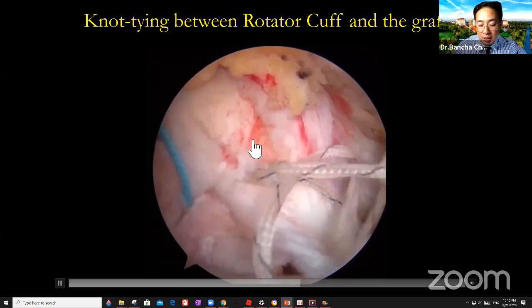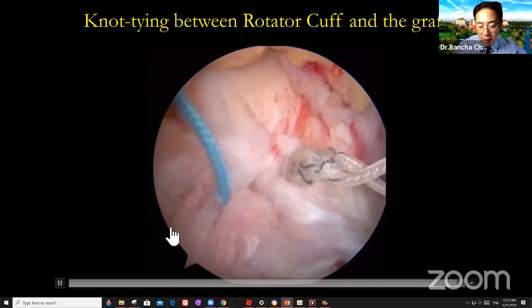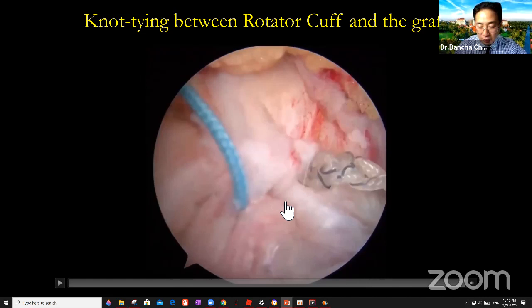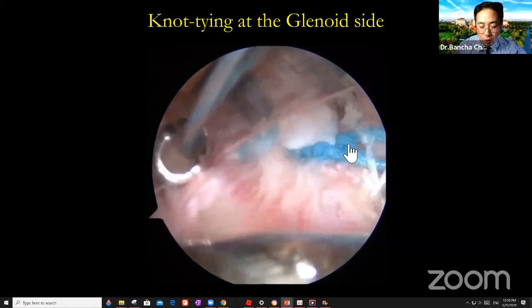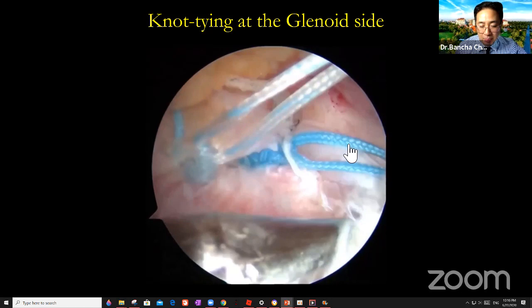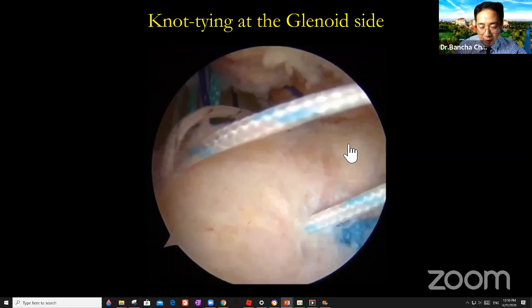And another trick is you can put the switching stick to push the graft, so it will not be floating. Okay, so you do this way, front, side to side repair, front and back. And then you tie the knot to the glenoid, one by one. So in one hole, I have two sutures. That is important because this graft is very thick.